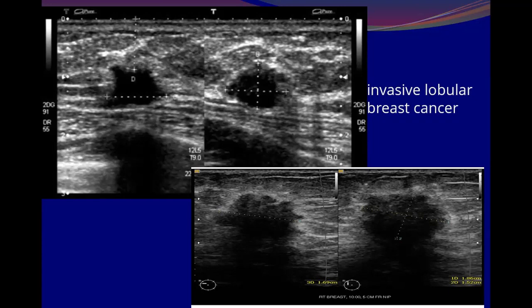Regarding the time gain, you mentioned that the subcutaneous fat should be medium gray. So in the lower image, it's medium gray. In the upper image, it's not, and that is why the lesion appears as a cyst in the upper image.